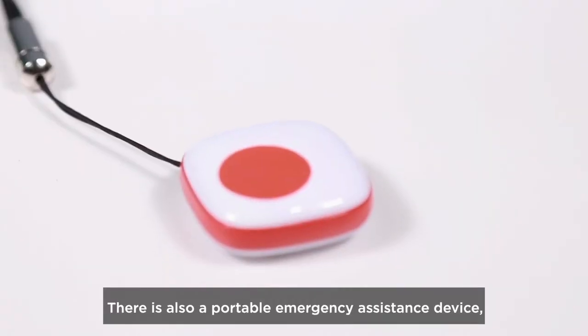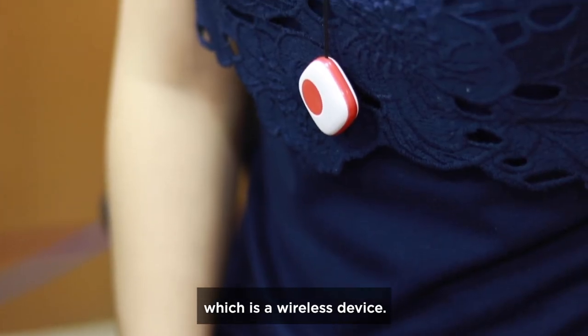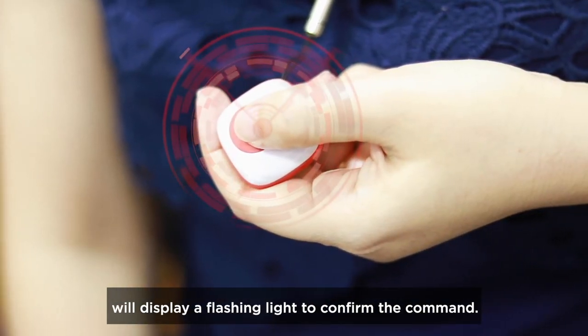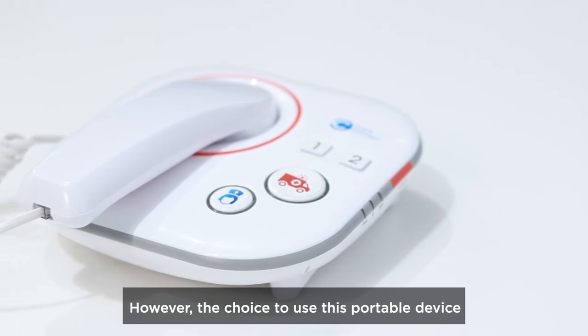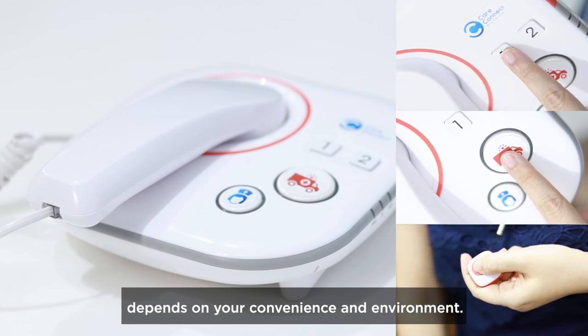There is also a portable emergency assistance device, which is a wireless device. Press and hold the button for three seconds. The device will display a flashing light to confirm the command. However, the choice to use this portable device depends on your convenience and environment.